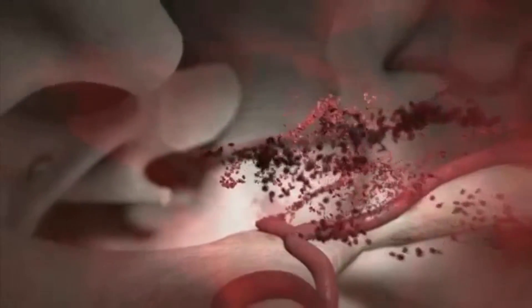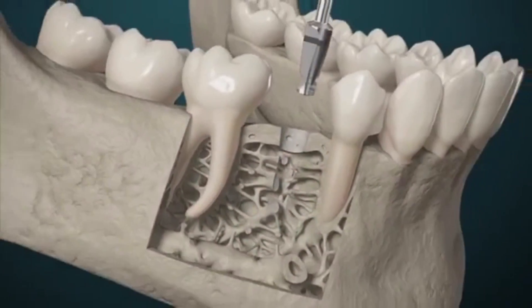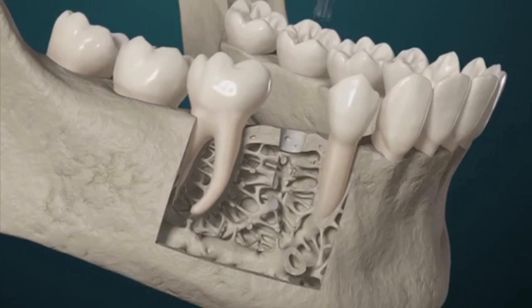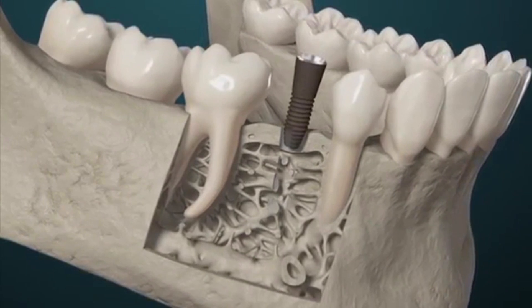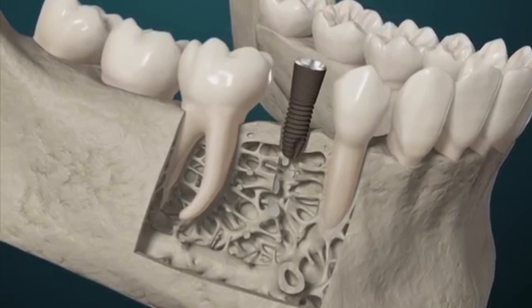The titanium implant is inserted where the tooth was previously lost. At first, the only force holding the implant in place is mechanical friction. This is called primary implant stability.